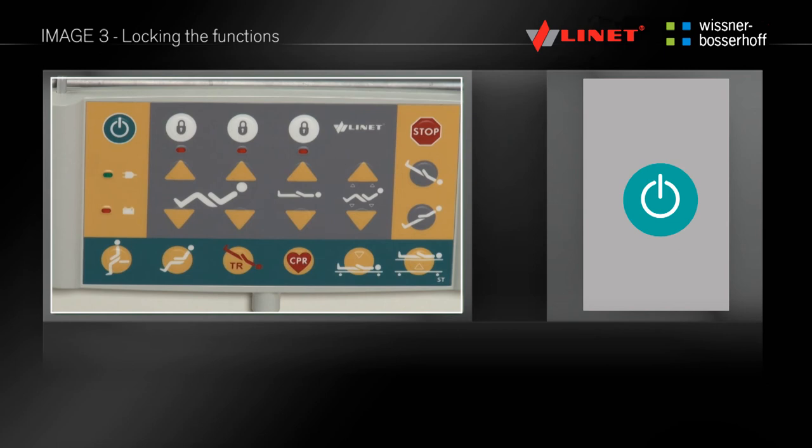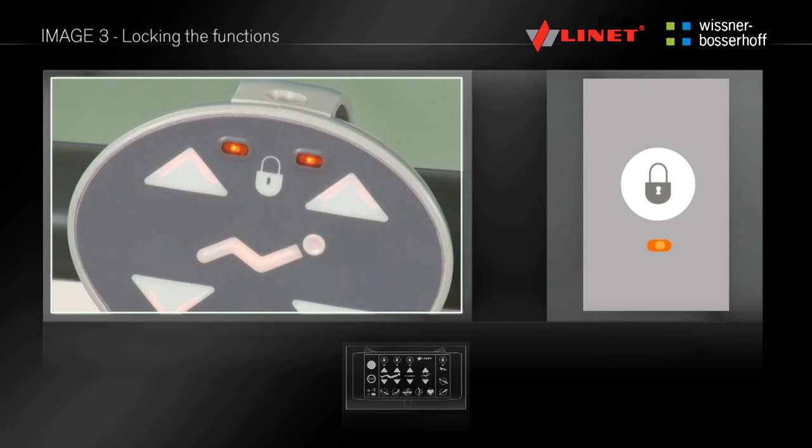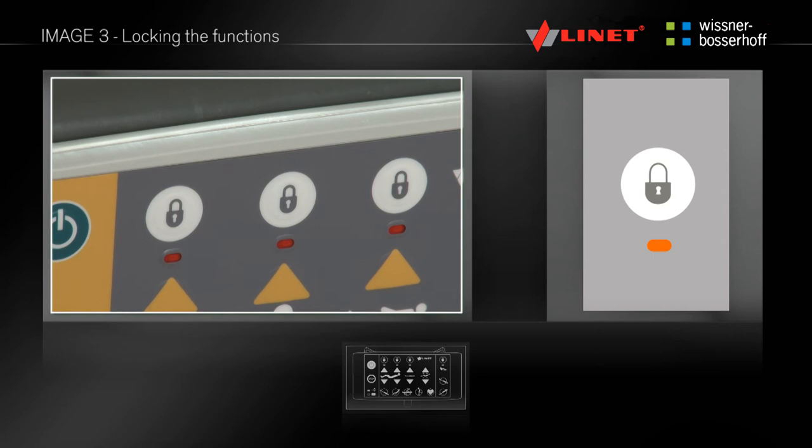To activate the locking function, press the go button. By pressing the white lock key located on the supervisor control panel over the desired function, you can lock the particular function. Once locked, the relevant functions are disabled on all control elements. Locked functions are indicated by the illumination of the LED diode on the supervisor control panel over the appropriate symbol. The function can be reactivated by pressing the appropriate lock button, indicated when the LED diode goes out.